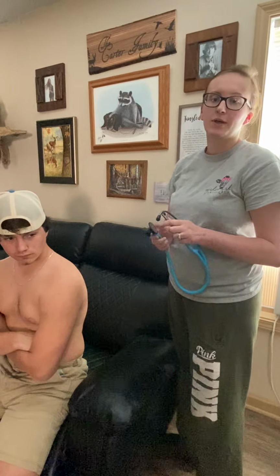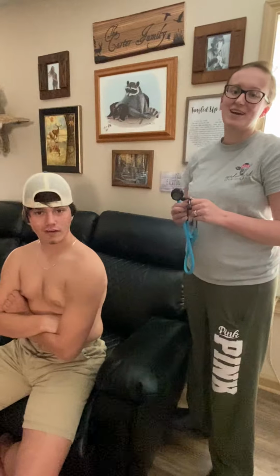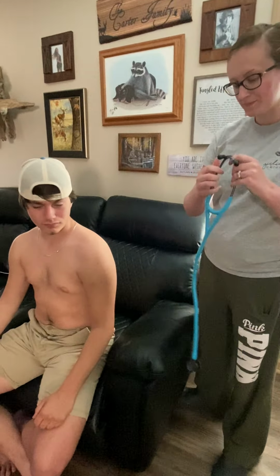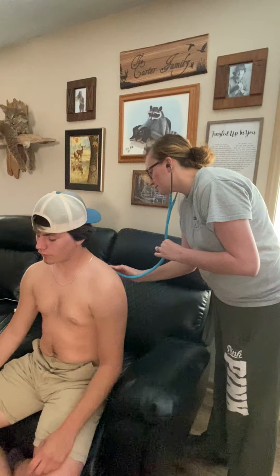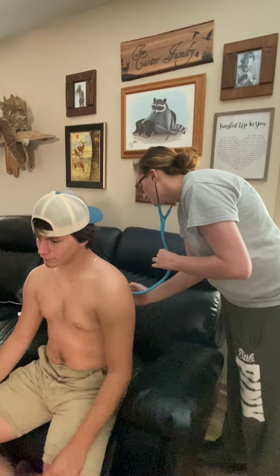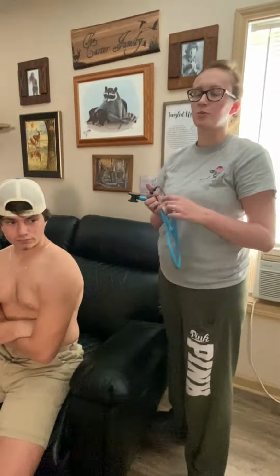So now I'll be performing bronchophony. During this, I'm going to have him say football as I'm auscultating his lung sounds. With that, it should sound muffled. If it's loud and clear, then that would mean it's abnormal. Okay. So now as you feel my stethoscope, I'm going to get you to say football, okay? Football. Football. Football. Okay. And it was muffled, which is normal.